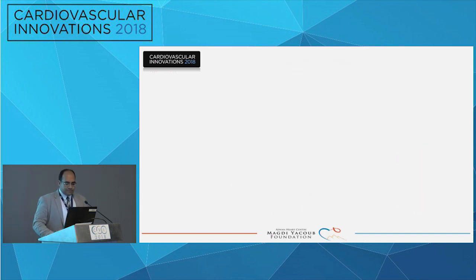So the plan? You couldn't make it look towards where the mitral was? Yeah. Facing anywhere else within the atrium? Yes.